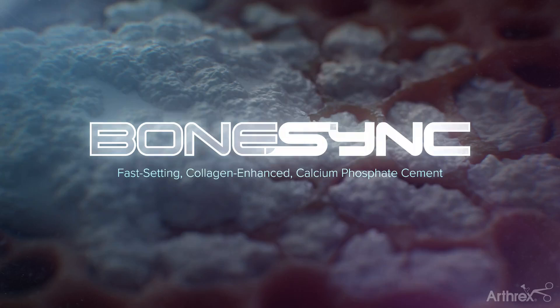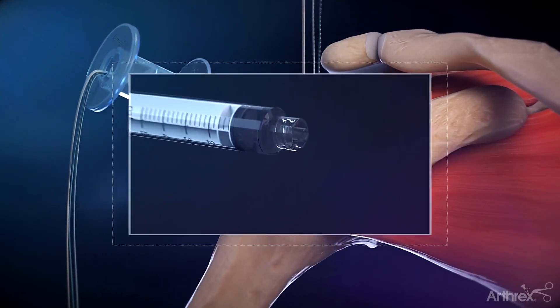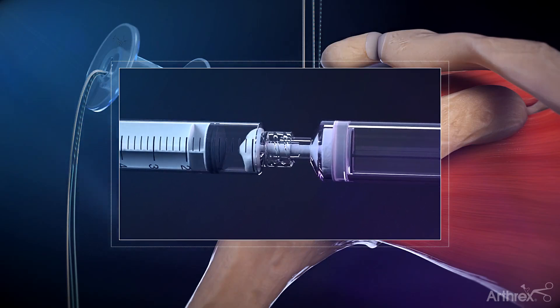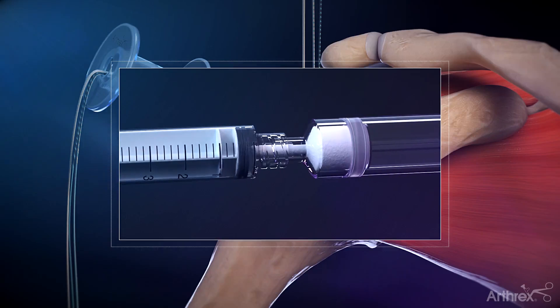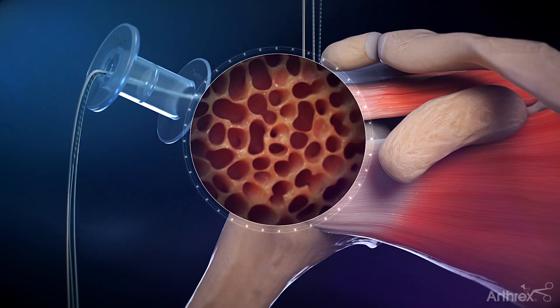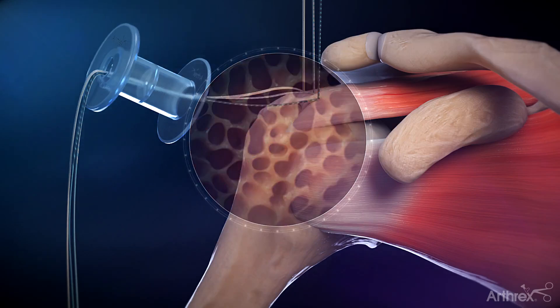Bone Sync Calcium Phosphate Cement is a collagen-enhanced bone void filler. This fast-setting, fast-remodeling biomimetic bone void filler uses a straightforward mixing system to deliver an injectable putty. The 1cc size offering is optimal for instances where a small bone void needs augmentation, such as poor quality bone when placing the lateral swivel lock anchors during a fiber tack speed bridge repair.